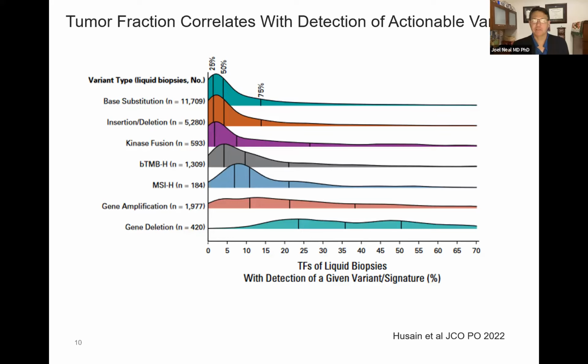I guess the tricky thing is for some of these really simple mutation cancers, and when I say simple, I mean EGFR, ALK, ROS1, RET, perhaps more the rearrangements. There aren't that many mutations overall. So how can you tell what the tumor fraction is in a less mutated cancer? You might be able to tell a definite negative in a smoking associated cancer because there's a lot different in the genome here. But in something like CML, you're only looking at one thing. And lung cancer has many-fold more mutations than that, but it's still tough to tell the tumor fraction.